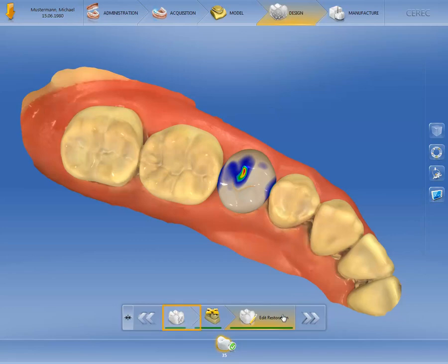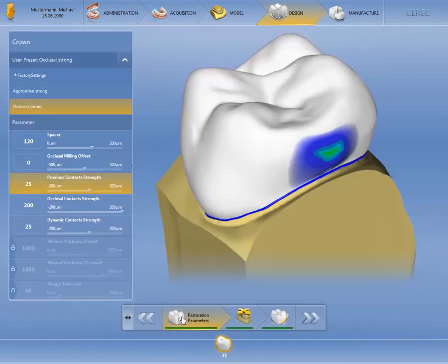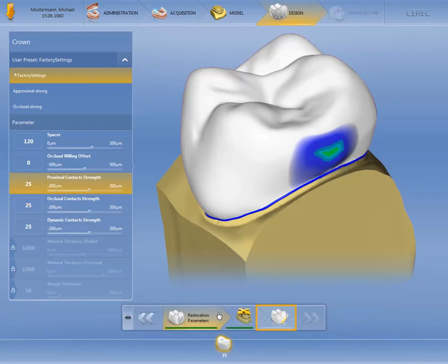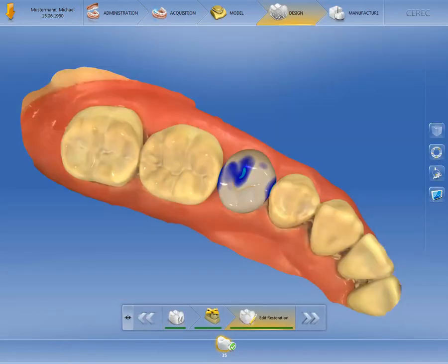You can, of course, revert to another individually created profile or the factory settings and calculate a new restoration suggestion. We will proceed by selecting the factory settings and confirming our entry again. The restoration has been recalculated based on the parameters for the factory settings, thus eliminating the deep occlusal penetration.